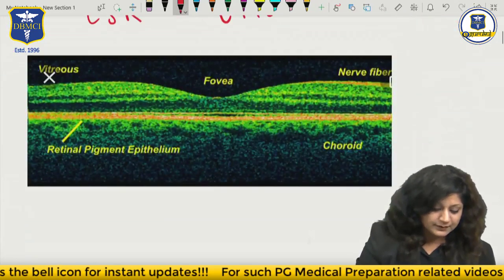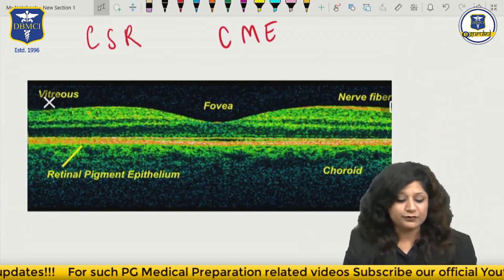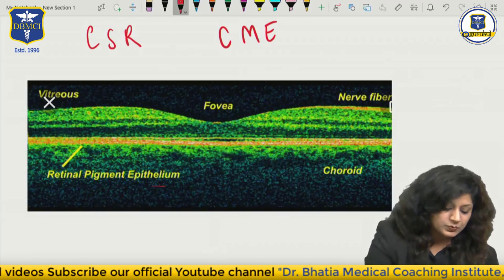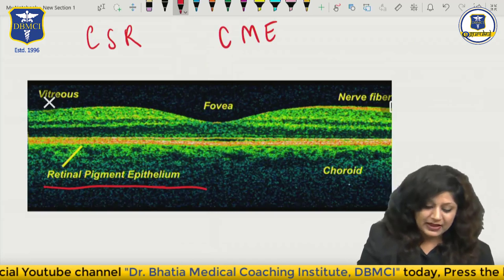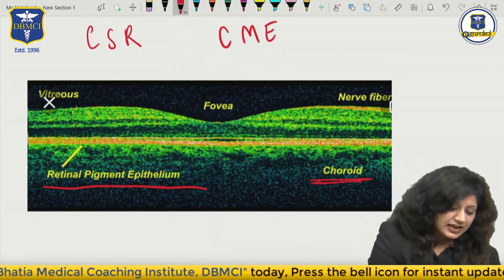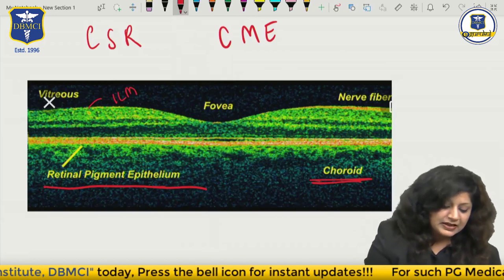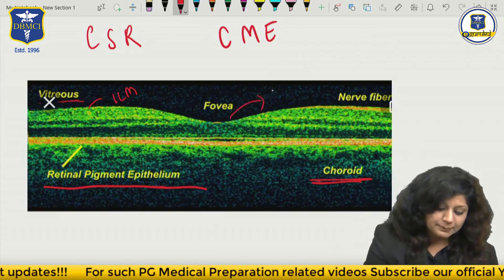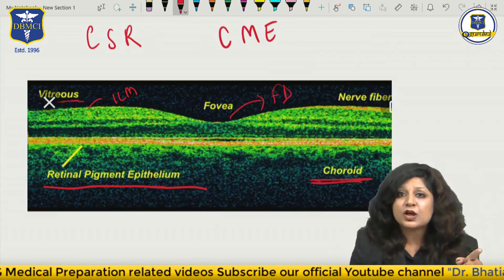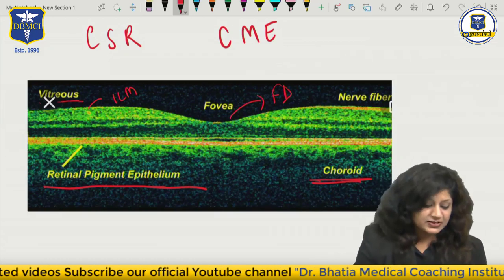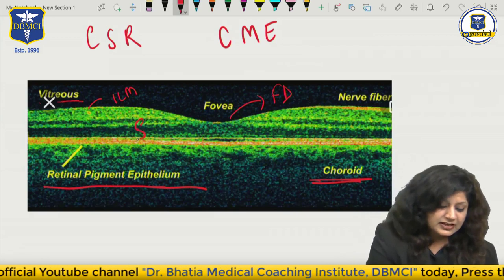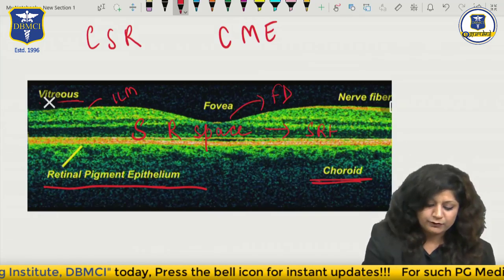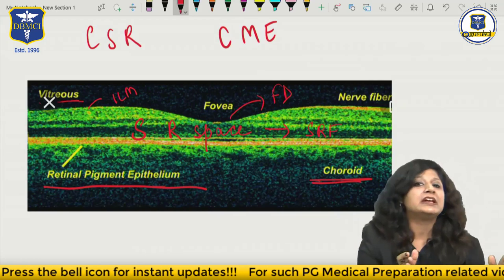Now see this one - it is just a replica of the previous one. Again, you can see the outermost layer is the retinal pigment epithelium towards the choroid. Then we can see the internal limiting membrane towards the vitreous. And this is the foveal depression here - foveal depression due to the absence of the ganglionic cell layer.